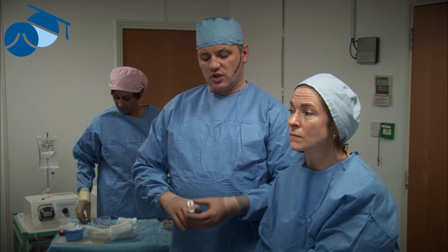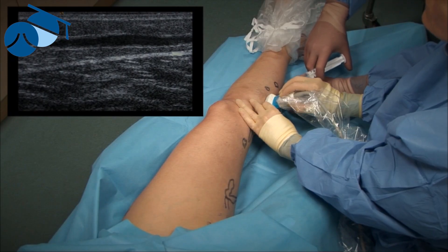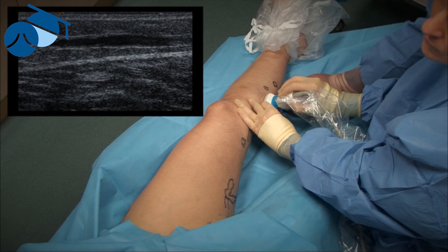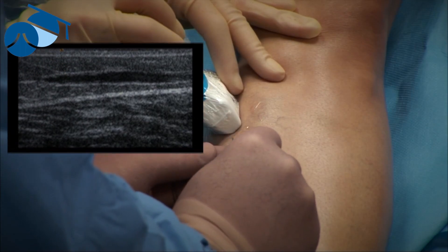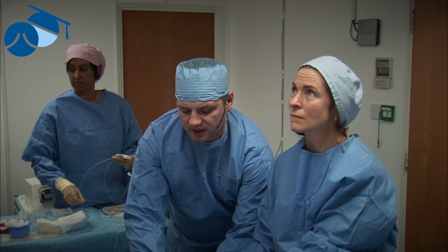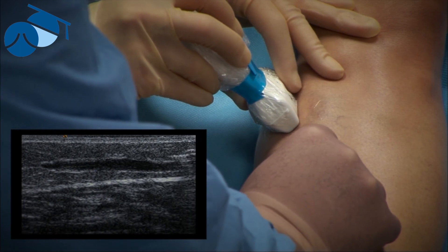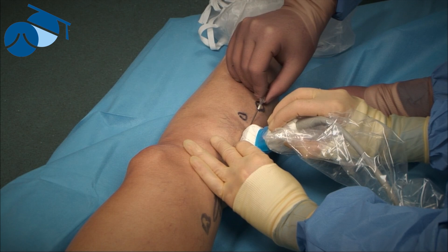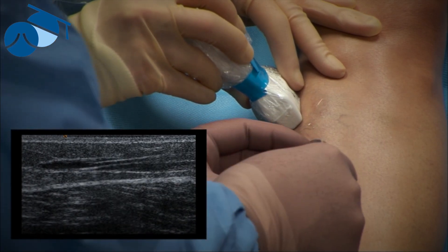We have a nice entry point here into the great saphenous vein. Just a little pinprick coming in — first we're anesthetizing the skin. Then we're going to use a micropuncture technique. You've got a lovely view of the remnants of the great saphenous vein. We pop the needle under the probe and then wiggle left side to side to find the plane. Once we find the ultrasound plane and get the maximum image of the bevel, we can go up and down because we know we're in the right plane, and we pop through into the vein itself. We can see blood coming out of the micropuncture needle, confirming we're in the lumen, which confirms what we see on the ultrasound.